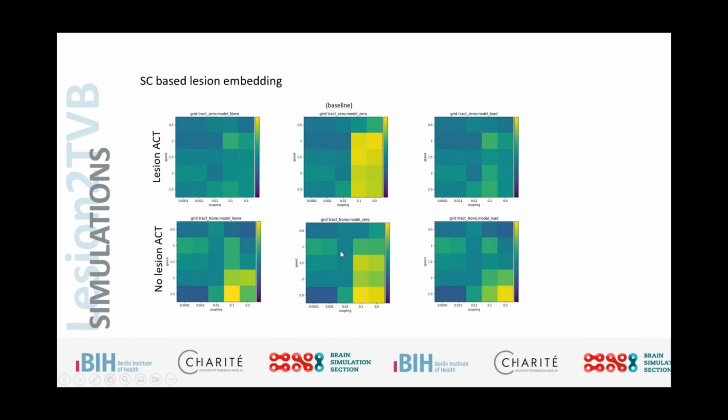of the processing and our lesion integration, similar to what we see, for example, with the cost function masking. We see at the end that downstream analysis might be significantly affected by the processing decisions that we made. So the question is, our baseline model, where we have the integration in anatomically constrained tractography (ACT) and we have the integration as just 0 weights, what does this mean?